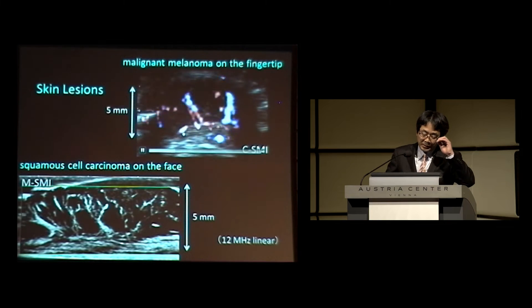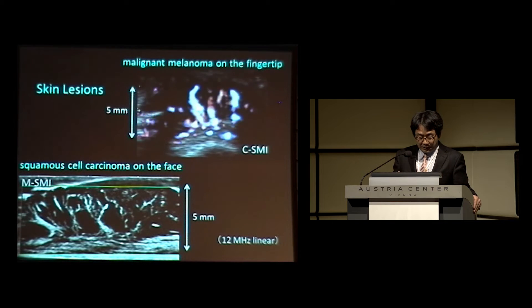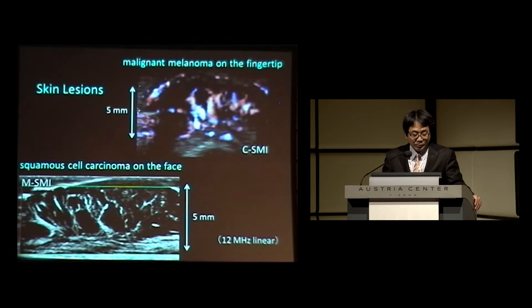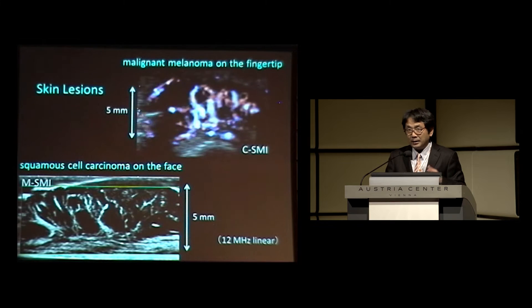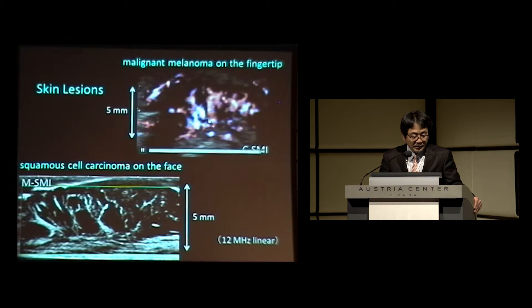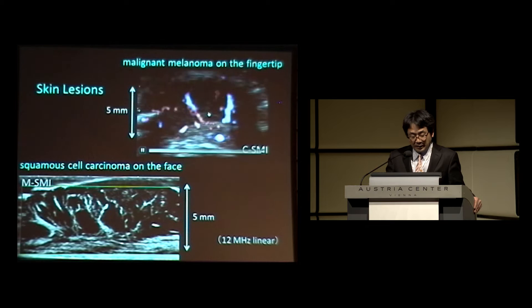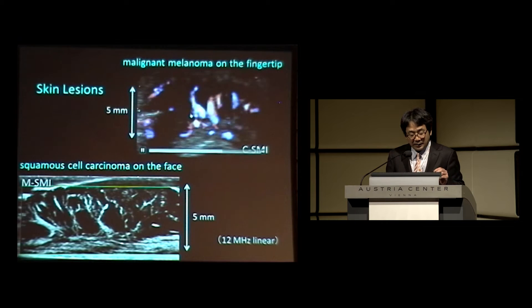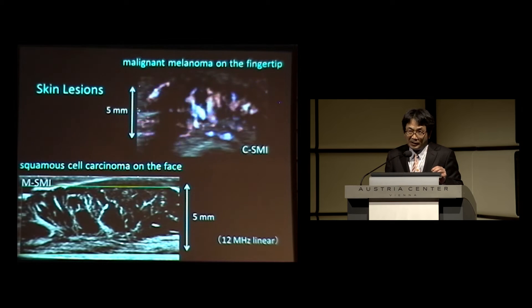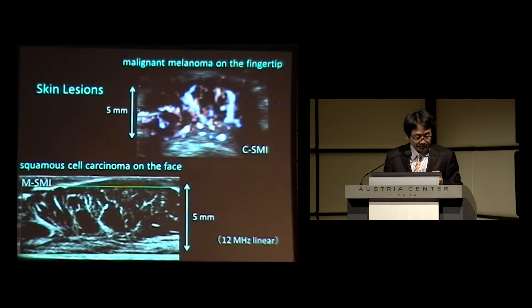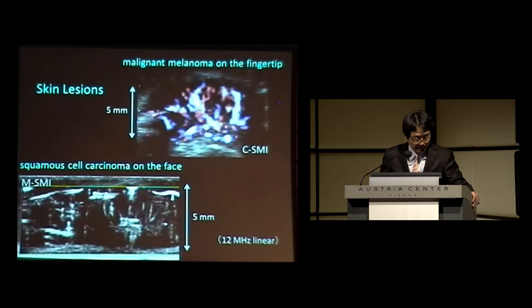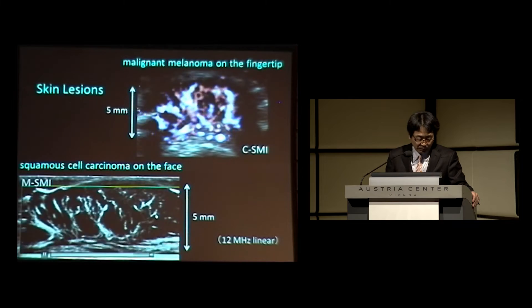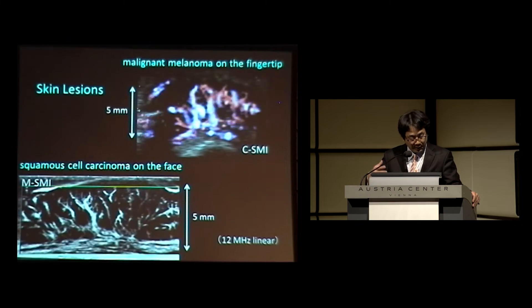Superficial lesions, such as skin lesions or superficial lymph node lesions, are good options for SMI, because you can use higher frequency probes without worrying about attenuation of the ultrasound beam. This is a malignant melanoma on the fingertip. Even in a tiny tumor like this, SMI can delineate the rich vascularity inside. The same applies to this squamous carcinoma on the face — also a very tiny tumor, but you can see a branch-like structure and rich vascularization.